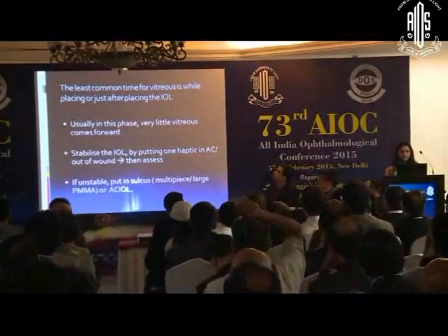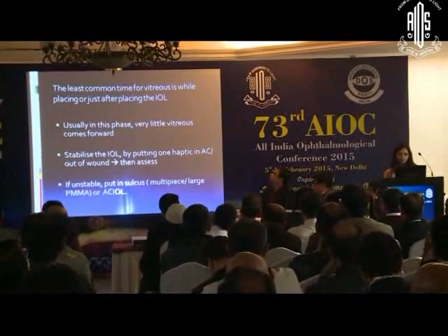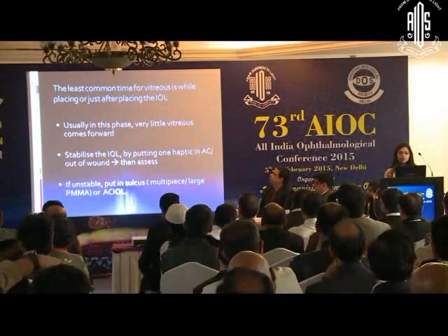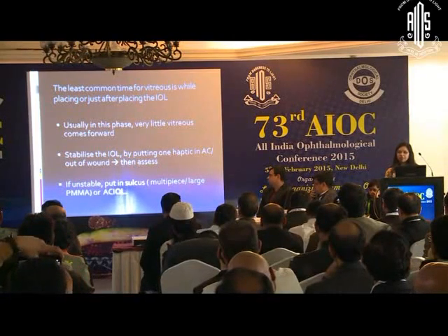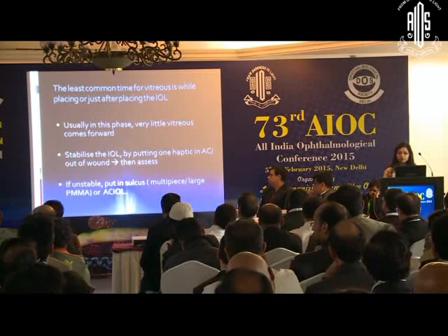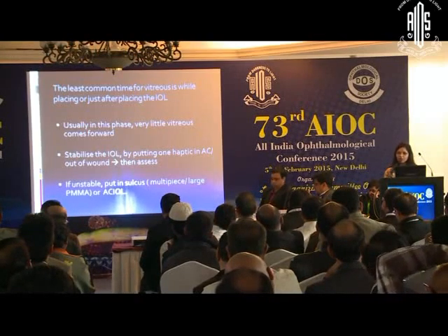You must stabilize the IOL in this case by putting one haptic in the AC and the other out of the wound, and then assess the situation. If you can safely put it in the bag, then it's okay. Otherwise, you can put it in the sulcus. If you want to put it in the sulcus, always remember a single piece cannot be put in the sulcus because it may constantly rub the iris. You have to consider using a multi-piece IOL or a large PMMA, or if that is also not possible, you can consider using an AC IOL or other types.